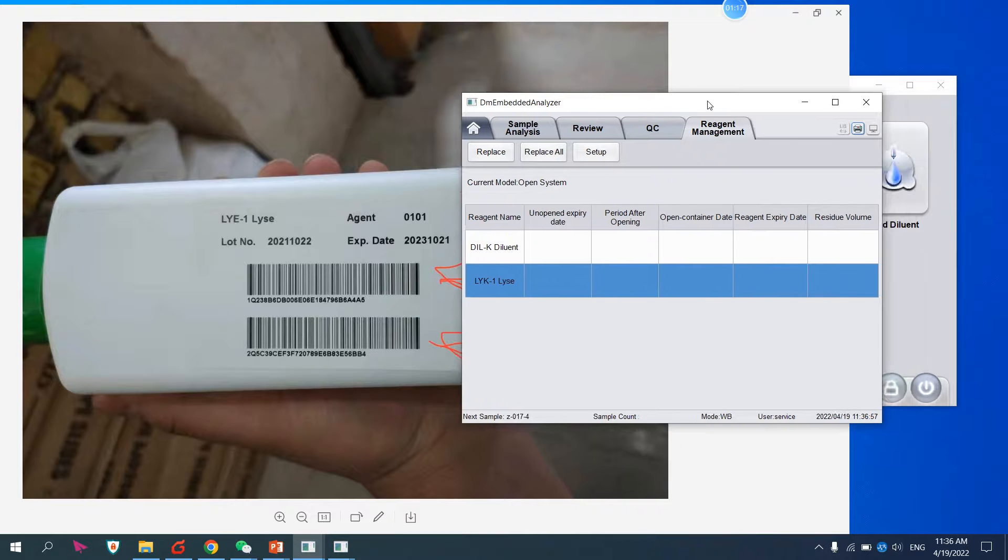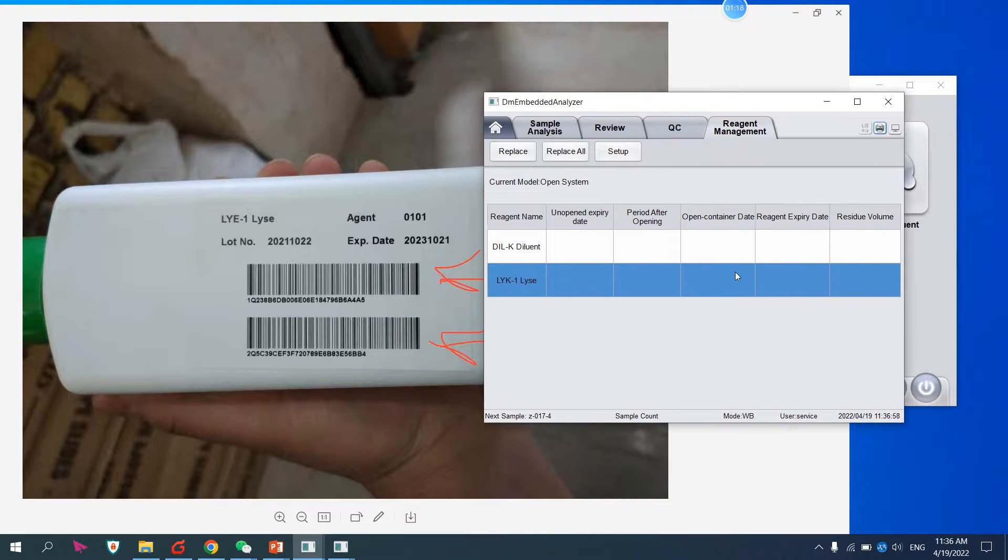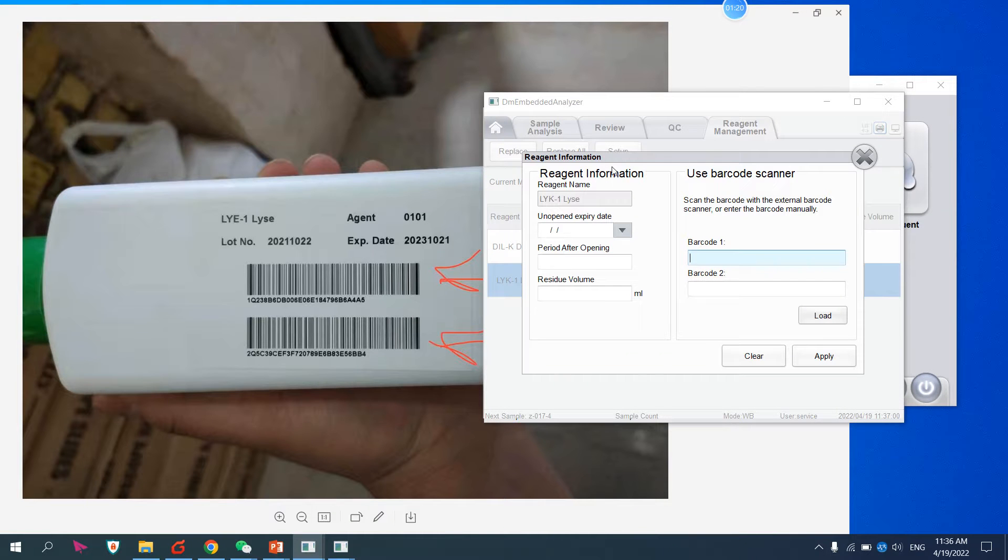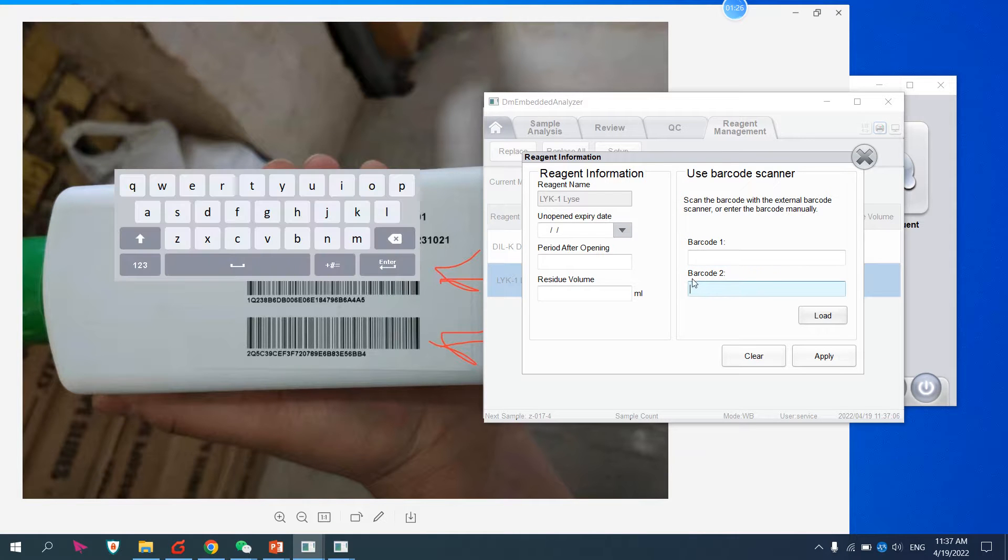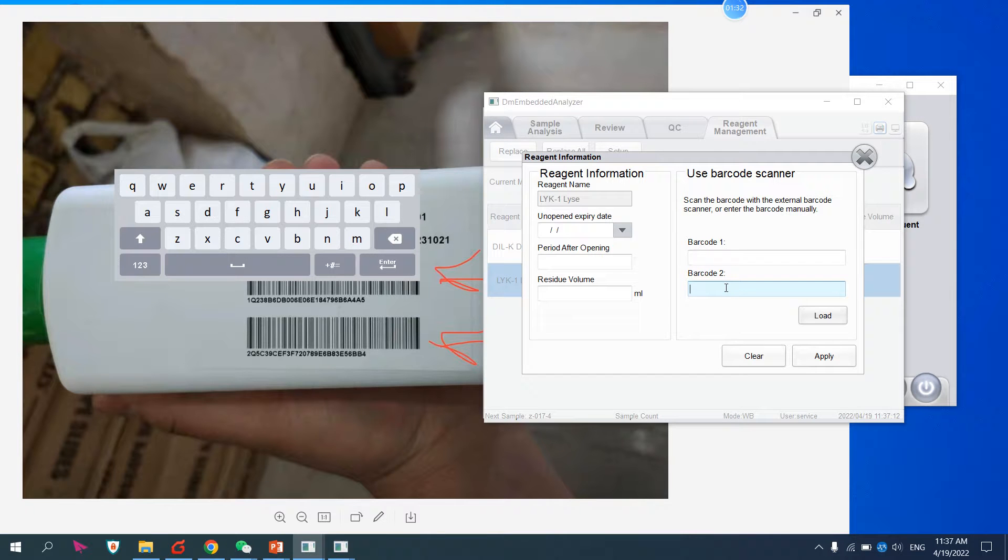Like this one, this one starts with 1. You have to input this value, and then for barcode 2 we will use this one. Put this one manually or by external barcode reader.